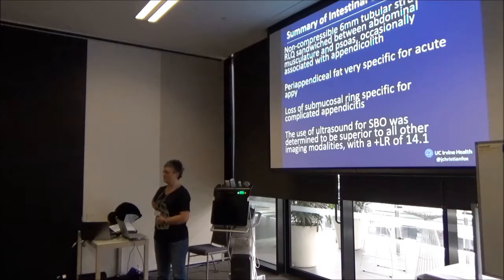Same thing with small bowel obstruction, frankly. You're just moving around the belly and compressing. Yes? Great to have you. Thanks for the talk, it was great. Now, in your department, if you find clinical appendicitis and confirm with the ultrasound, how comfortable are surgeons to take that patient to the OR without a CT scan?